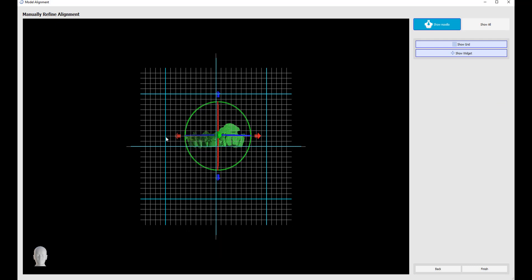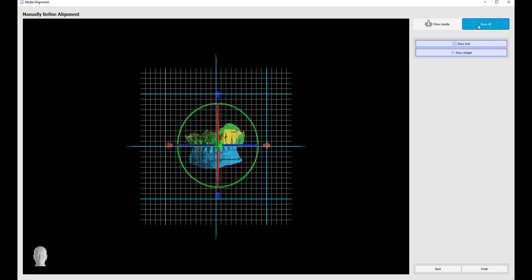We now have a widget that we could use to fine-tune the model alignments, to move or to rotate the model. We also have two buttons on the top right to show maxilla or show all, which will show us all of the relevant models which we selected. We could toggle on the grid and the widget. Once we're happy with alignment, we click finish.